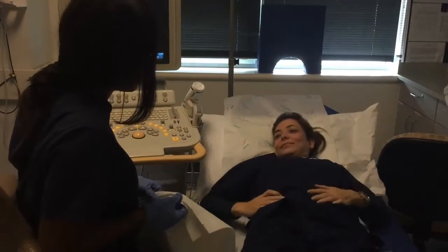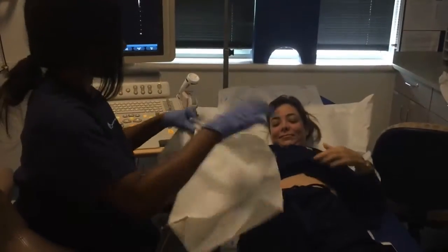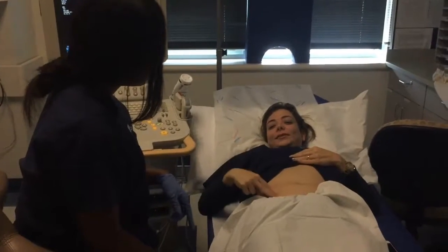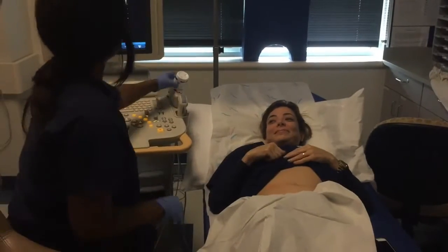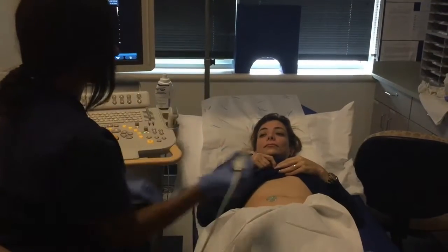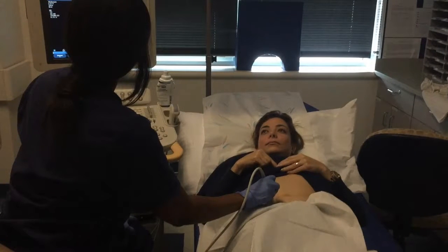As you see in this video, this patient is experiencing right lower quadrant pain, and she recalls pain at McBurney's point, which is called rebound tenderness. When a patient presents with right lower quadrant pain, it may be suggestive of acute appendicitis, and the sonographer should ask where the patient feels the pain and start scanning at that location. An inflamed appendix can be seen 90% of the time.